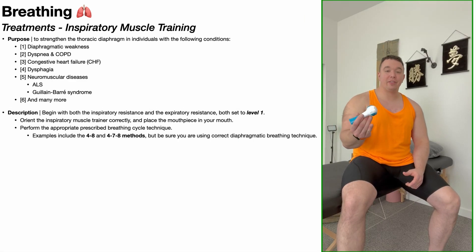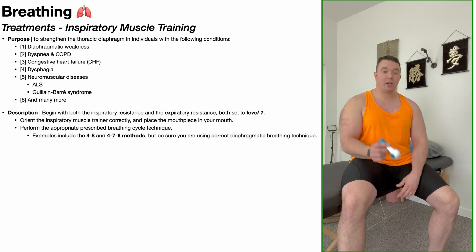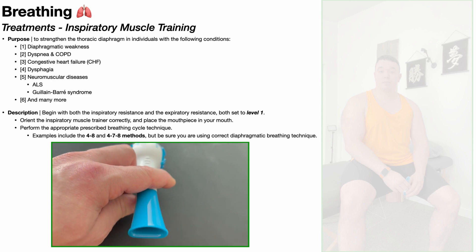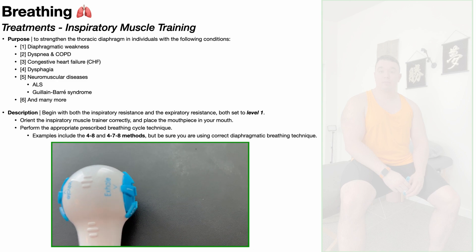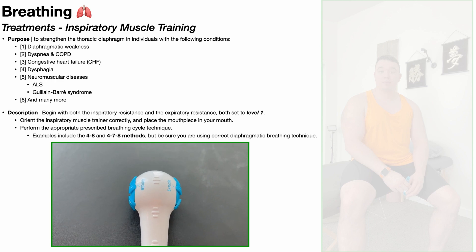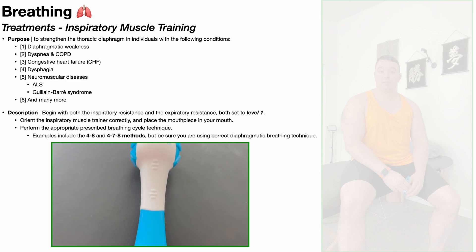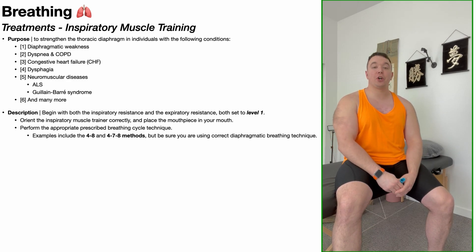Using an inspiratory muscle trainer is actually quite simple. Probably the most complicated part is learning which side goes up and which side goes down. For this particular device, right here is the mouthpiece — you put your mouth on that to inhale and exhale through. On the left side we have the inhalation settings; you can see the dial there, set to level one. On the right side is the exhalation setting, also set to level one. You position it such that the inhalation settings are on the left and the exhalation settings are on the right — so what you're looking at here is the top of the device.